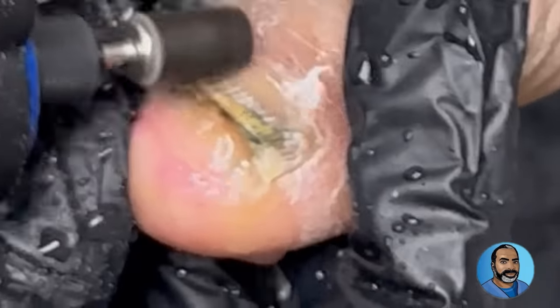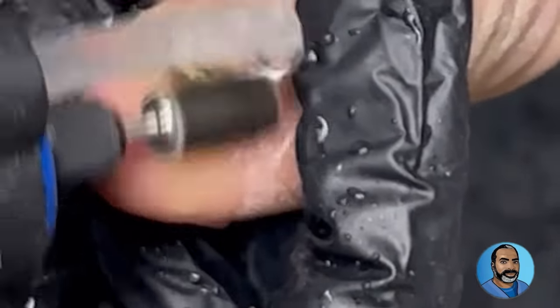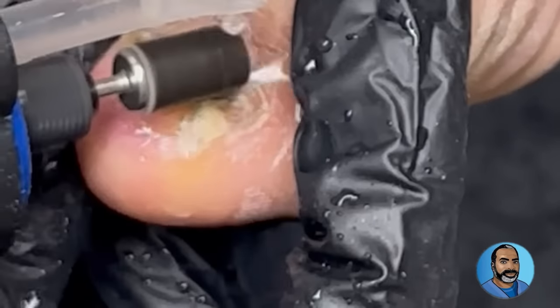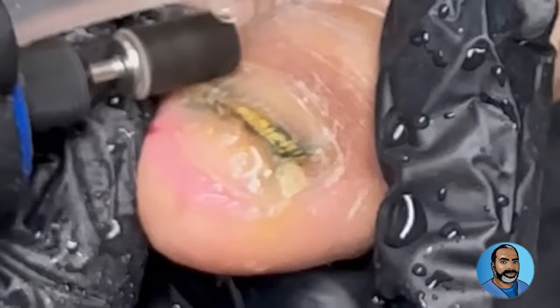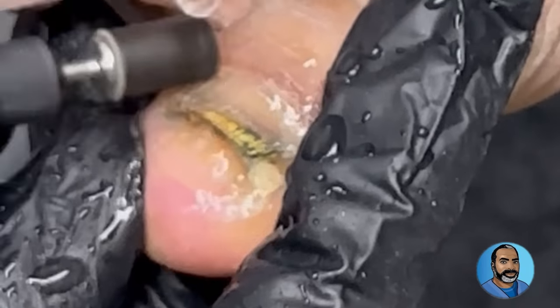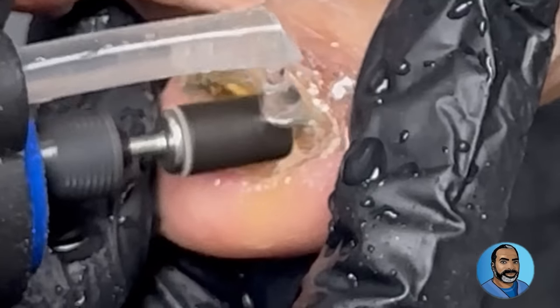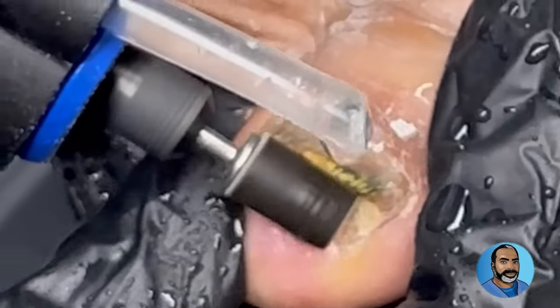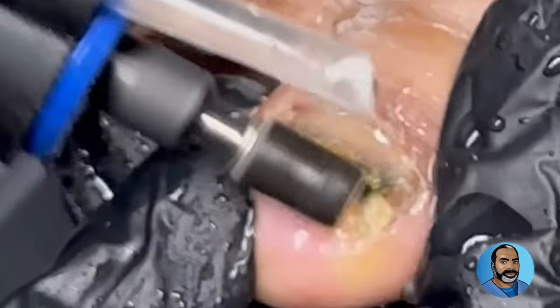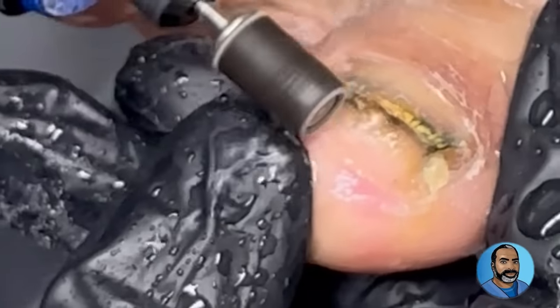Why not just remove the entire nail and be done with it? Well, first of all, that doesn't get rid of the entire problem. The problem is not just the nail plate — the infection is also in the nail bed and the nail root. The base of the nail plate is firmly attached to the nail bed in this patient, so removing the entire nail would require a surgical procedure.